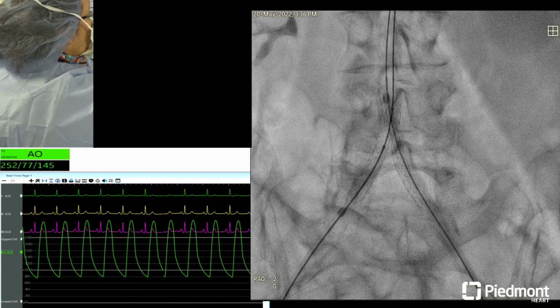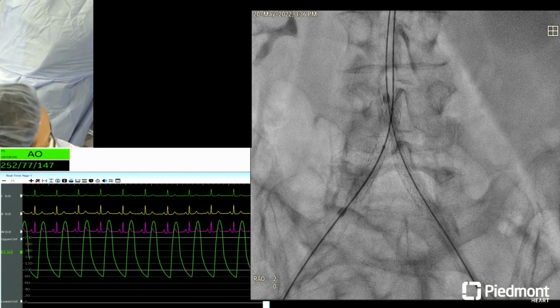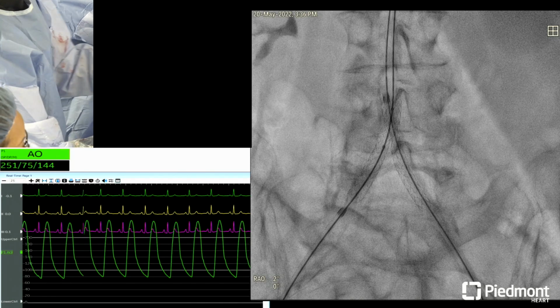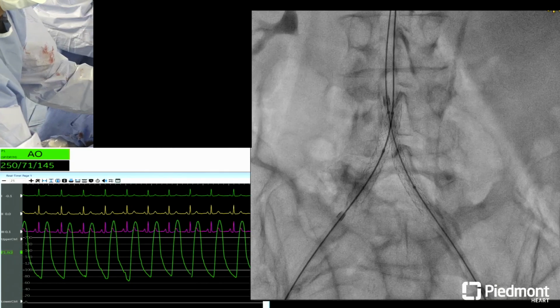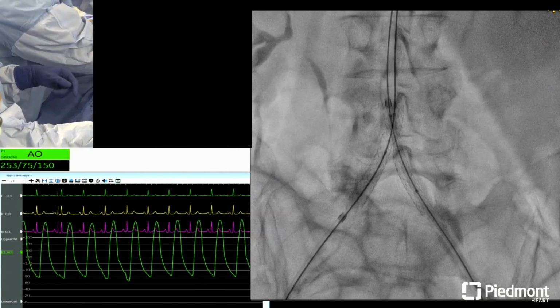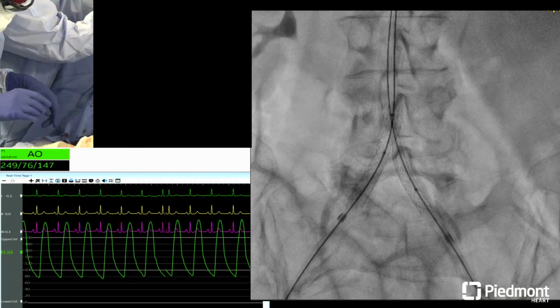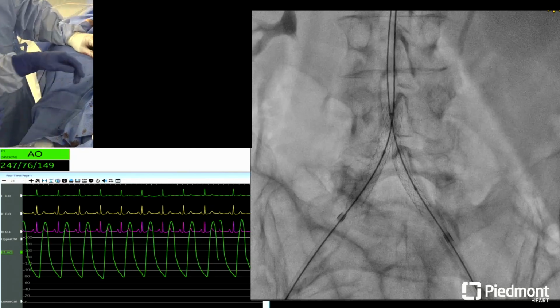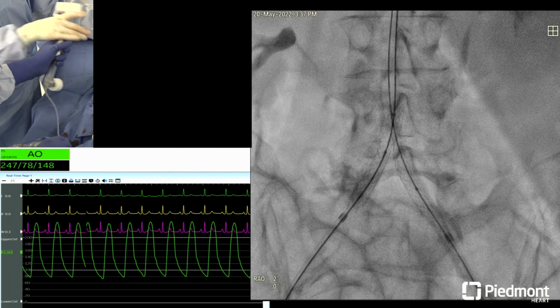So just tell us quickly what your next few steps are going to be here, Drew. Sure. We're going to do some post-dills, try to make everything look as pretty as we can. We've got to take the 740 sheath down. We have a 740 now on the left for a little bit more length on post-dill. We'll do some kissing here and try to further expand exactly what's going on. And then we're probably going to do some self-expanding stents below.